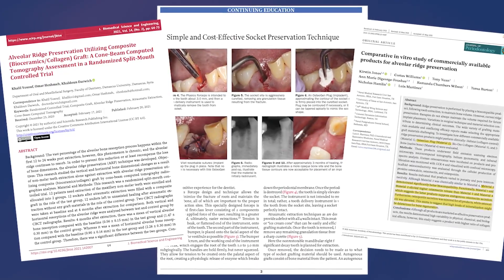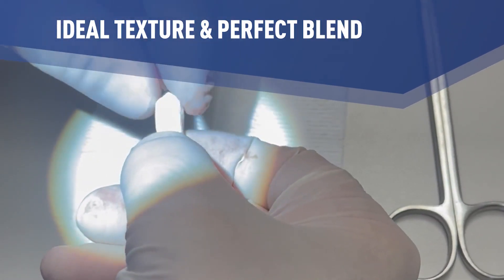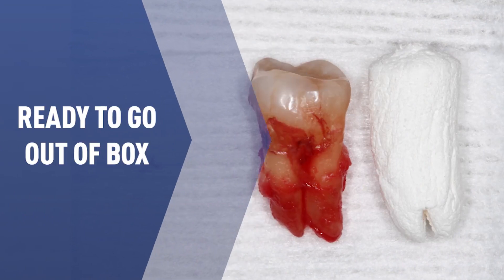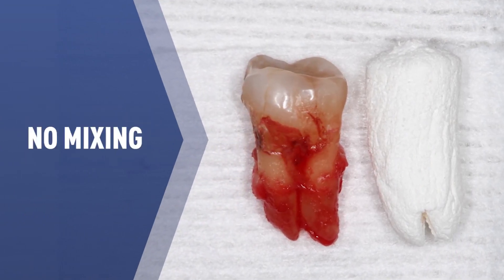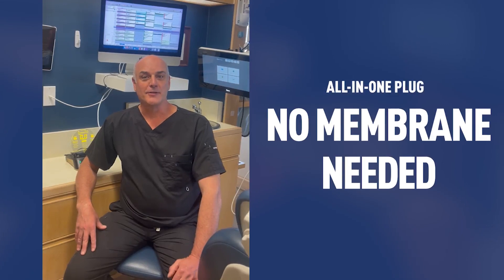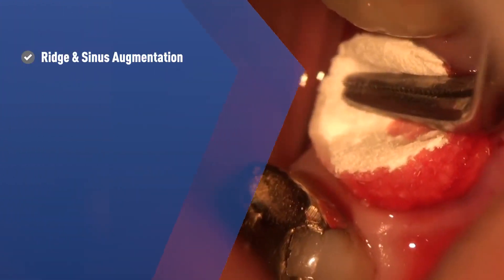These plugs are the ideal texture so they won't fall apart. A blend of collagen with non-ceramic bone grafting crystals makes them ready to go right out of the box — no mixing or packing particulate. But the best part is there's no need for a membrane; the plug is an all-in-one.